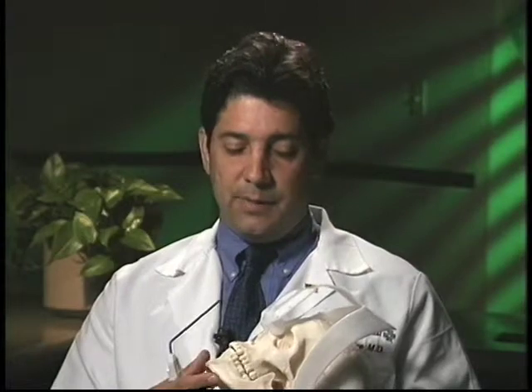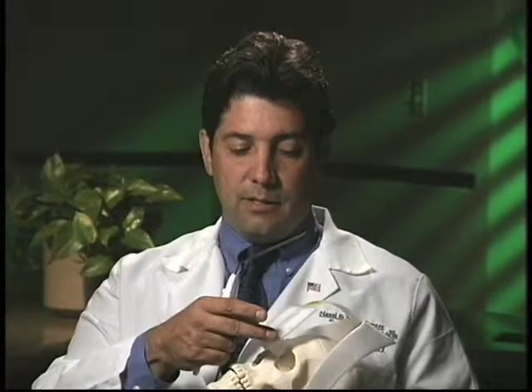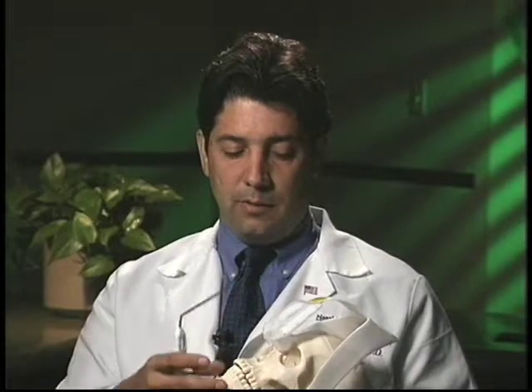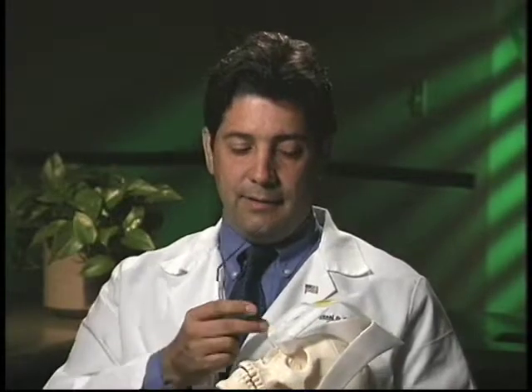Well, pretend this is Joe the patient, and he is going to be scheduled for a CAT scan. With image-guided technology, what we do is we put this headpiece on the patient at the time of the CAT scan. This is on the bridge of the nose, and there are 6 small little metal sensors. And when the CAT scan is being done, these are slices that are through the head. These 6 points are used as reference points. What that allows us to do, in a very comfortable way, is allow a patient to have a very special CAT scan. When he's done, he takes the headpiece off.